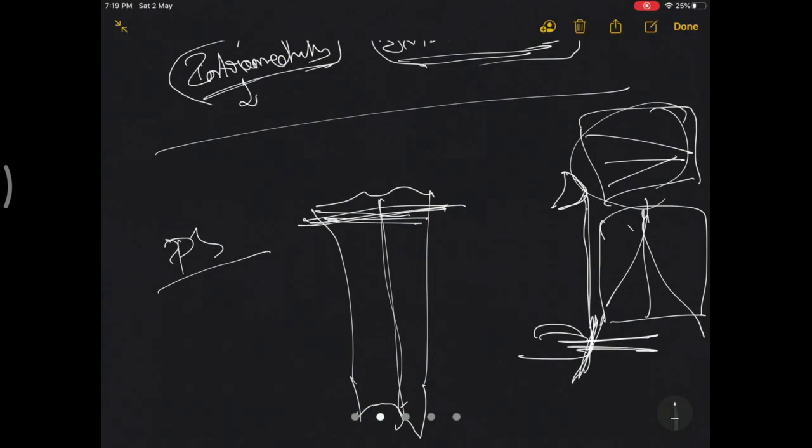So in PS, the tendency is to have a parallel cut, whereas in CR, since you have to get the same strain in the PCL as preoperative for better functionality in the postoperative period, you will have to mimic each of the steps like a native knee. So you will try to mimic the slope of the preoperative knee which you have calculated from the preoperative planning.